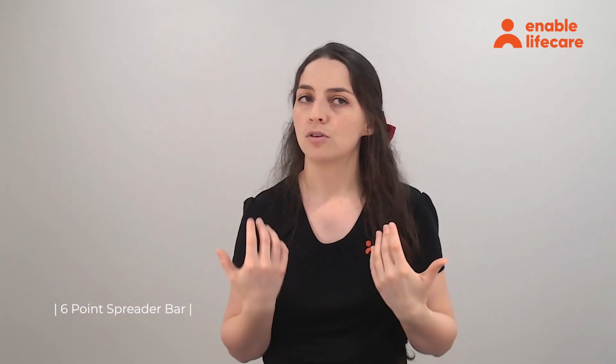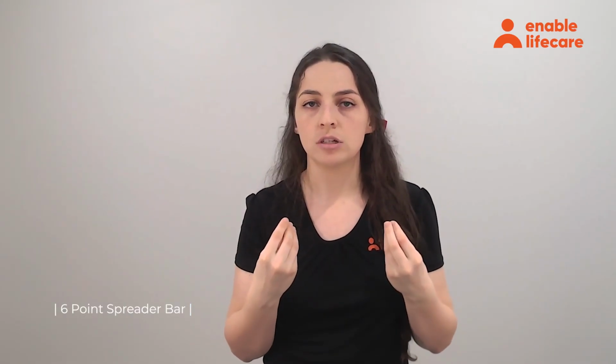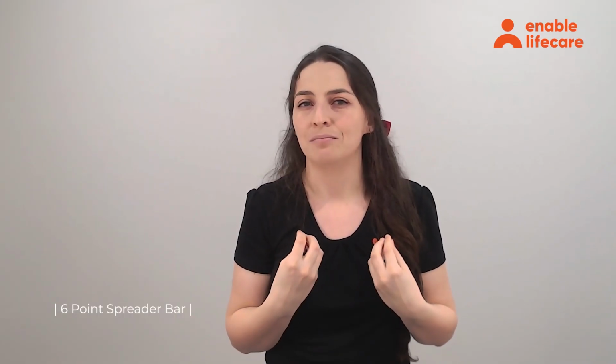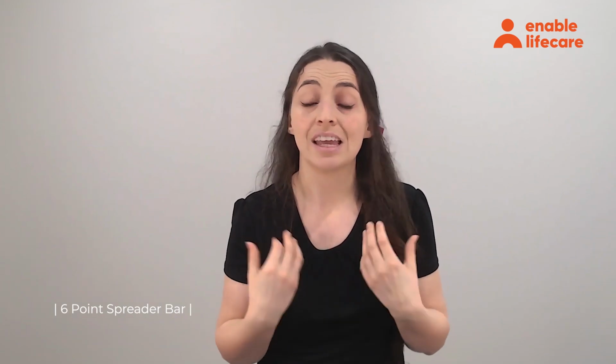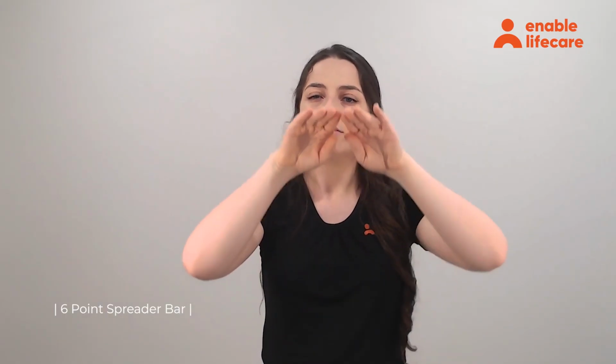Something we also need to look at when we're looking at attachment types is not just how many attachment points we have, but what does that attachment type look like? For example, you can get your 2 and 4 point spreader bars that are kind of in this coat hanger style. These ones are going to be very much close to the client's face. It's going to be a more closed in position. So if you do have someone that might have some involuntary movements or behaviors, they might actually hit their head on this attachment type.